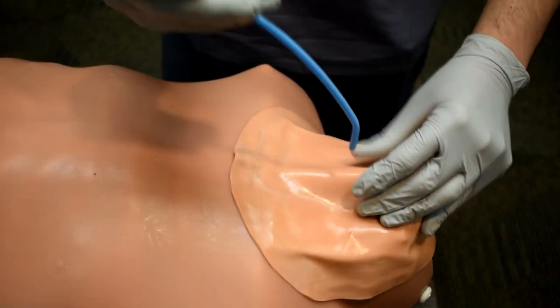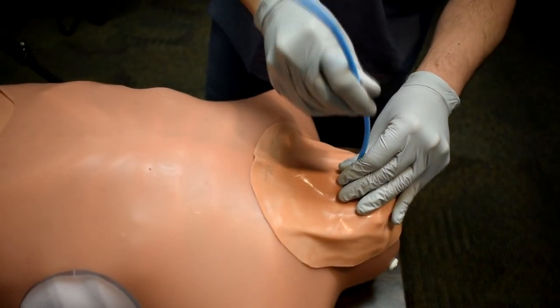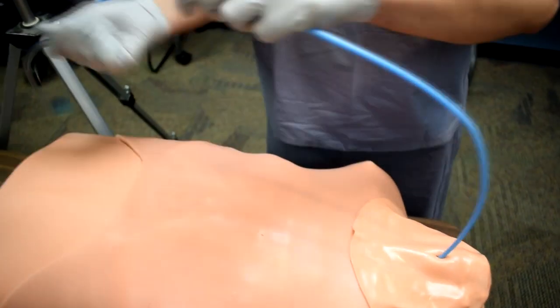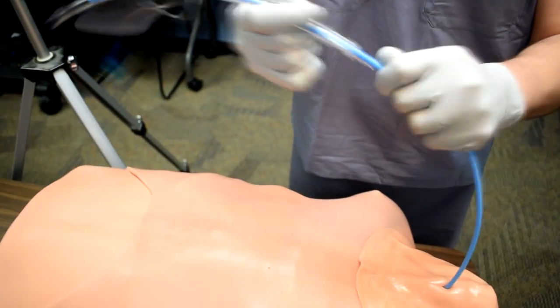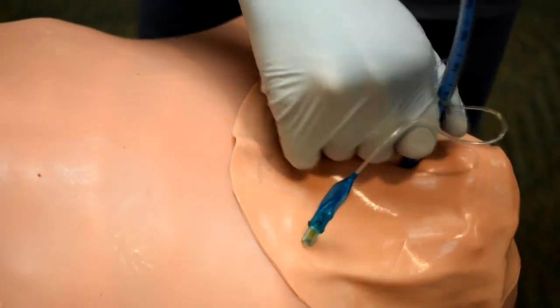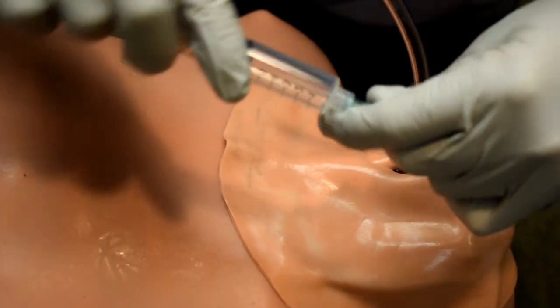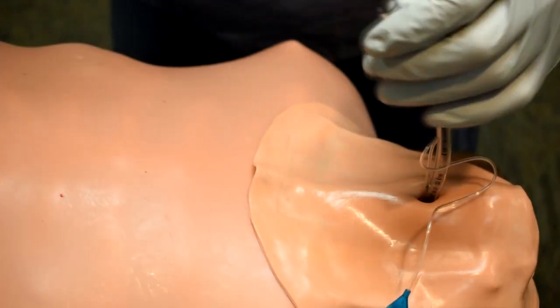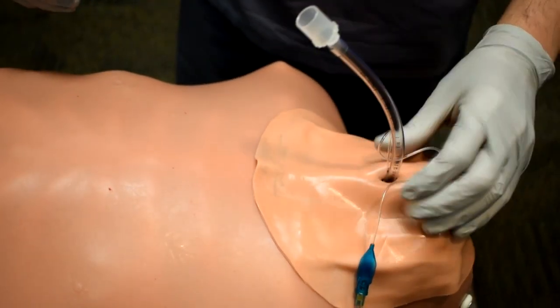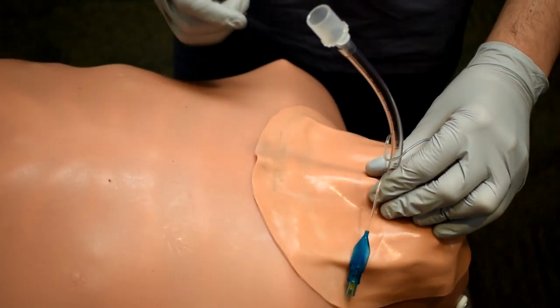I use a bougie catheter to slide in, and I slide it, and I can feel it going along the trachea. Then I'm going to take my ET tube, and I'm going to slide it over the bougie catheter and slide it into the airway. Once the cuff is in, I can remove the bougie, just like before, and I can inflate the cuff, and then we can attach our ET tube to a BVM or to a ventilator in order to oxygenate and ventilate the patient, and I'm going to hold this in place. This is our surgical airway.